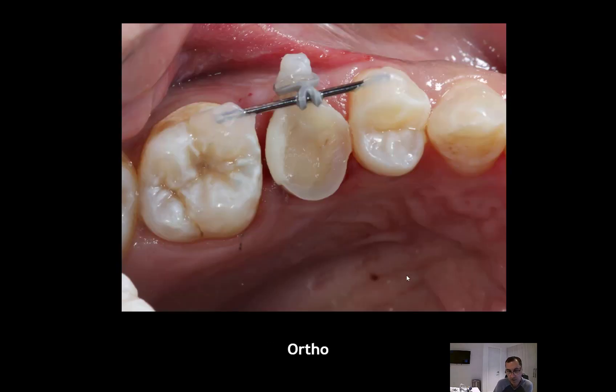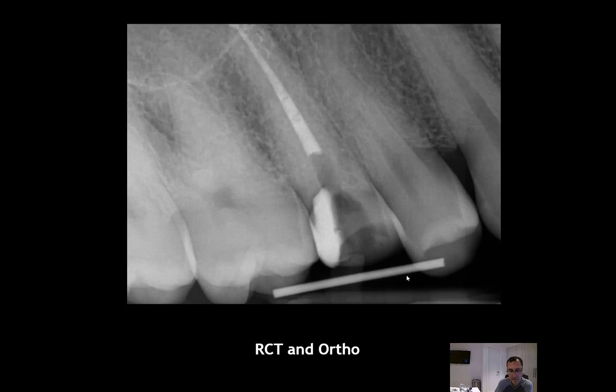In the first appointment, we did the root canal as you can see here, and also excavated the cavity and sealed the distal box — making sure the hypochlorite irrigation solution was contained. In that first appointment, I placed the power chain with a metal wire on the buccal side.